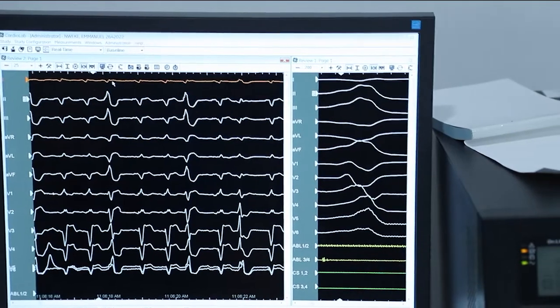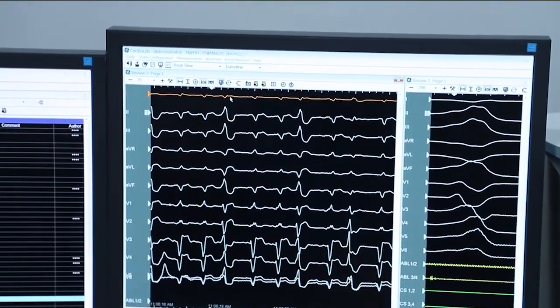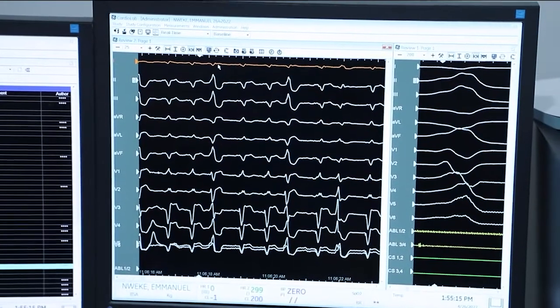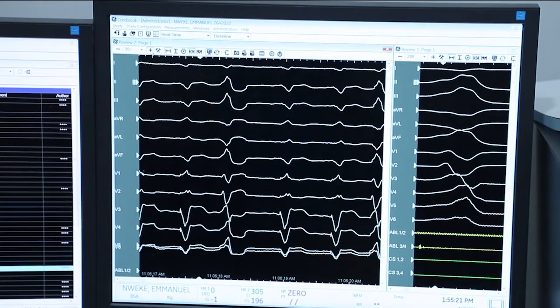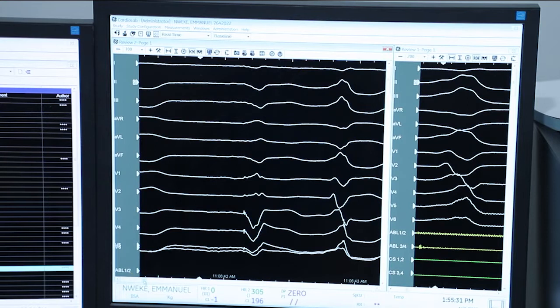We suspect a left-sided origin definitely, and being dilated cardiomyopathy, an area of the LV summit or basal anterior wall is our target, and definitely these PVCs are of epicardial origin, as the MDI is more than 0.6.